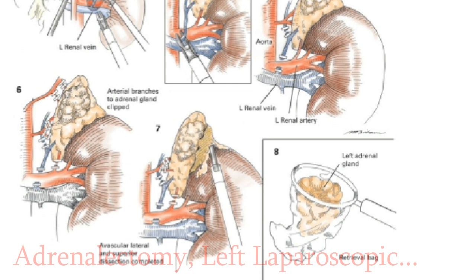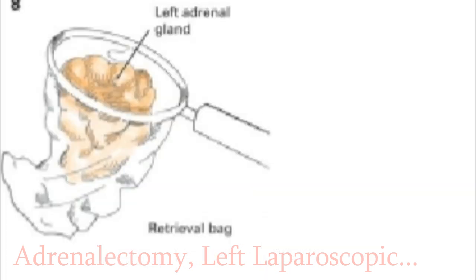The inferior attachments are divided. Finally, the vascular lateral and superior attachments are dissected. The gland is now free for extraction in a laparoscopic retrieval bag. The technique for extraction is described under laparoscopic right adrenalectomy. The tumor bed is then inspected for any evidence of bleeding and any additional hemostasis obtained. The retraction on the pancreas is released and it is returned to its normal position.